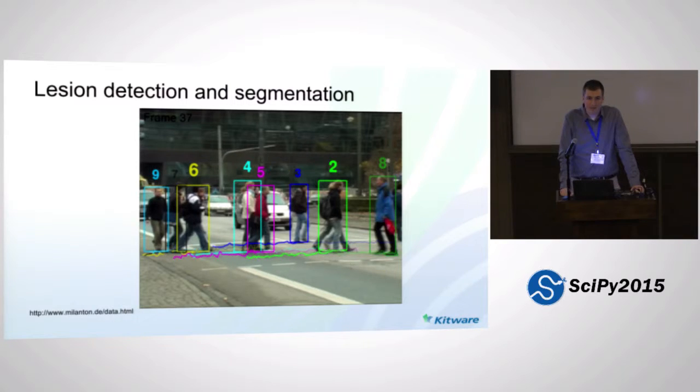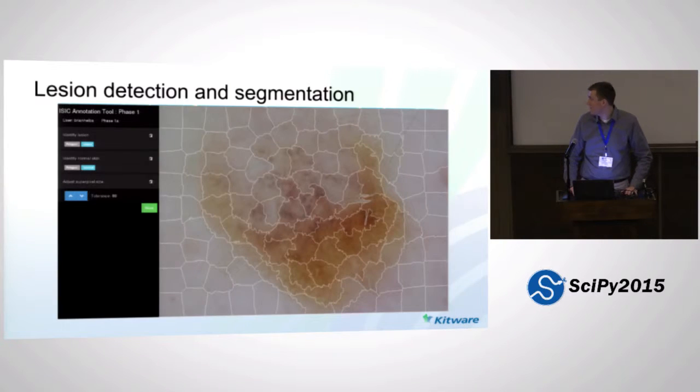So typically in computer vision, when you do ground truthing, you maybe draw a bounding box around objects of interest. The problem with this is there's a high degree of random variability in this. You can be off in one direction by 1 pixel and not know it. There's a huge amount of variability, and also it's not necessarily very precise for highly contoured regions. It's great to draw a square box, but you're not going to draw very sophisticated polygons.